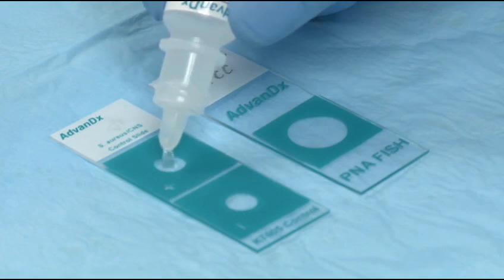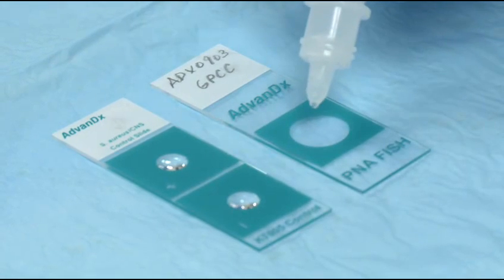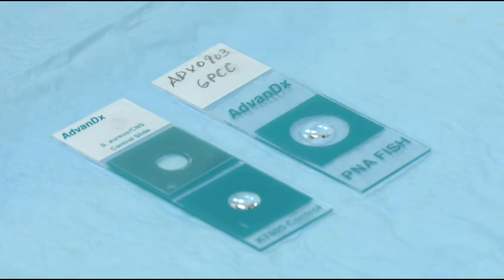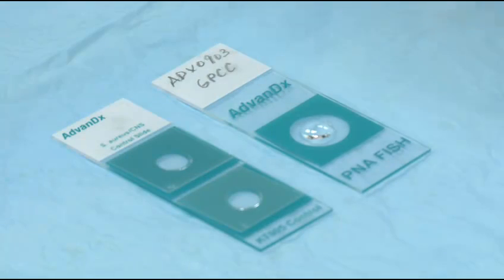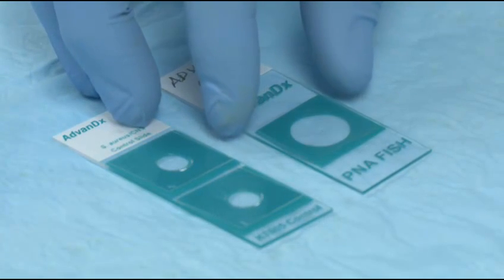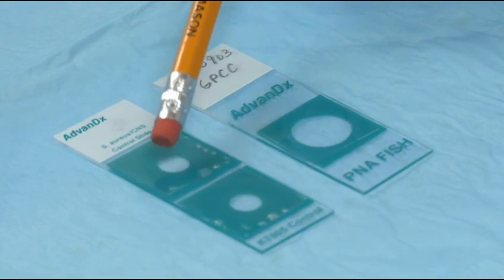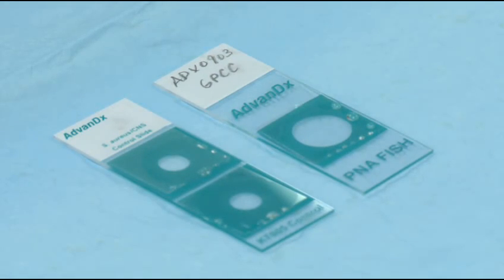Once dry, add one drop of mounting medium to each well along with the cover slip. Push on the cover slip to remove any excess mounting medium and ensure the cover slips sit in place over the wells.